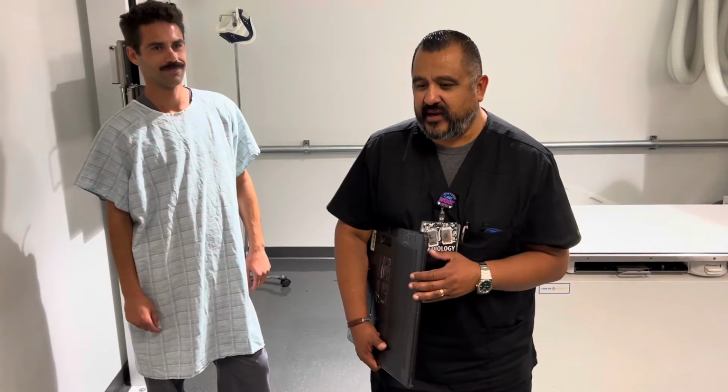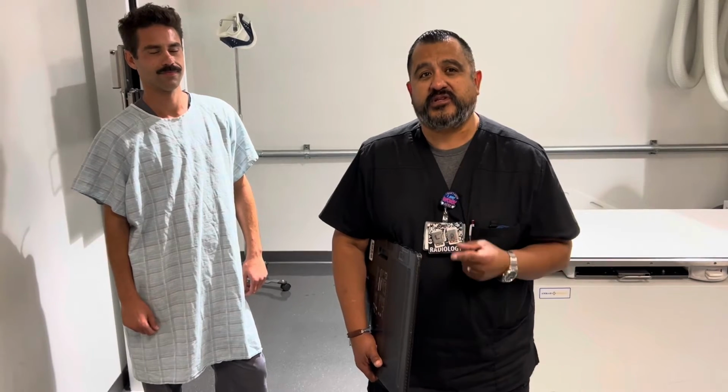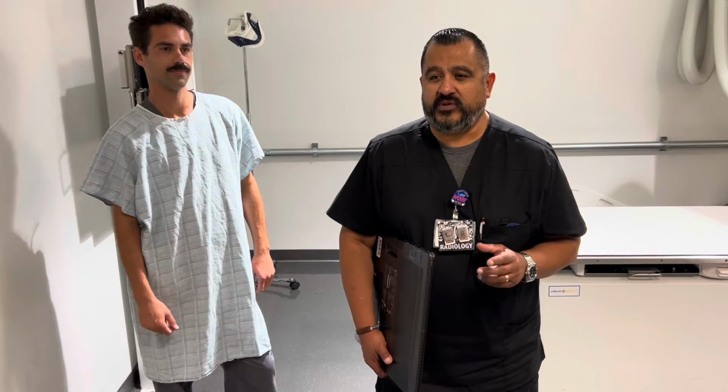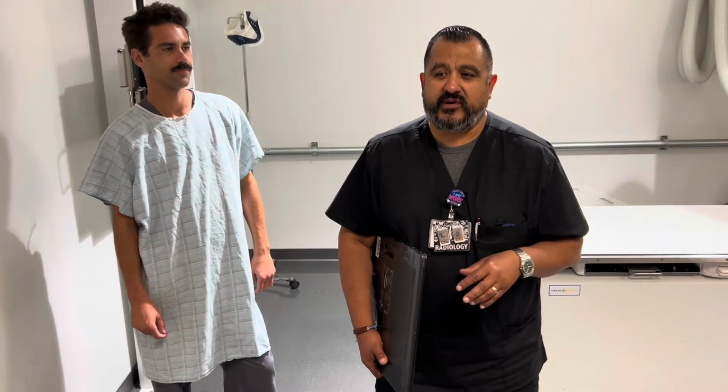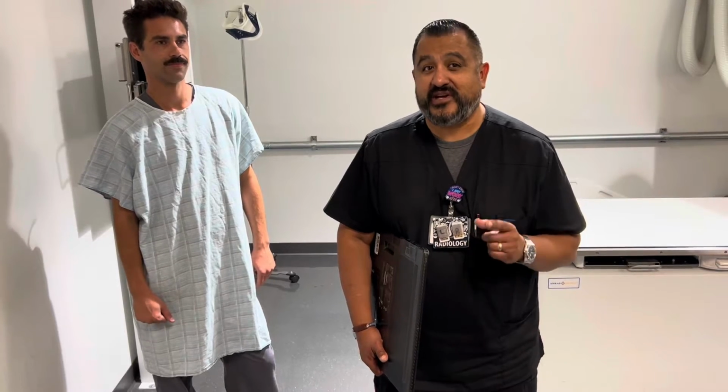We were asked to do some videos on ribs, so we're going to do two separate videos. The first one is going to be on the upper ribs. So we'll do upper ribs above the diaphragm, and we'll do anterior, posterior, and axillary rib injury. I'll explain the difference to you, and I'll tell you exactly what projections to do.